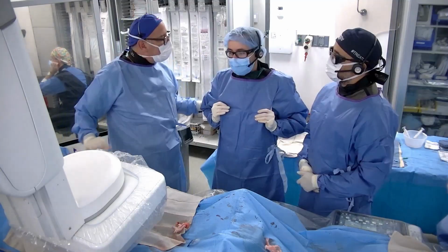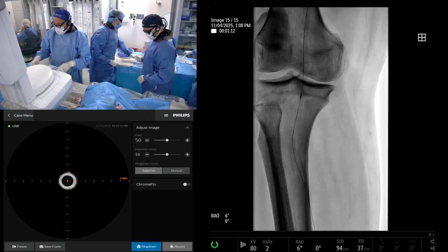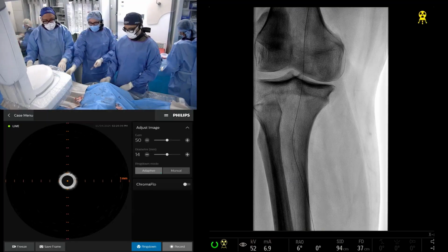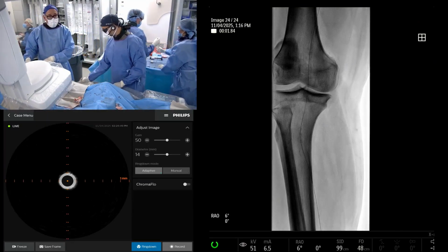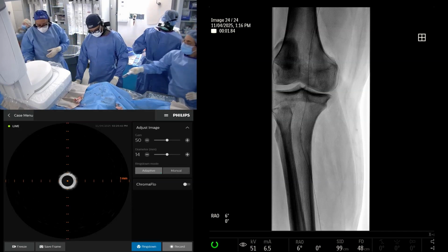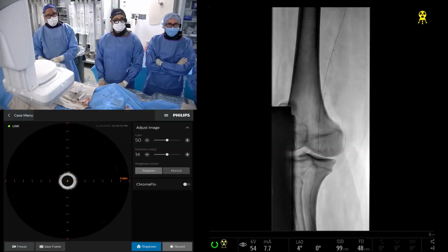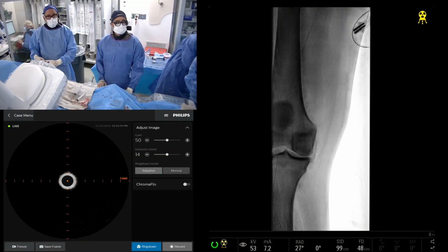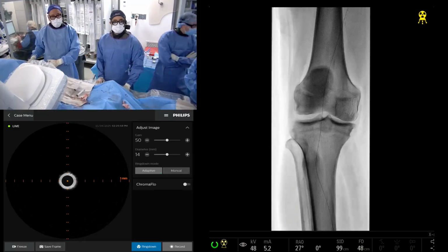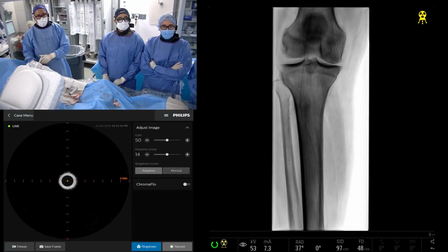Right. Let's do a full angiogram now. All right, there you go. Sorry, can I get the angles right so we can see what we're doing? Lightning 6, we want, right? Yeah. Yep, thanks.